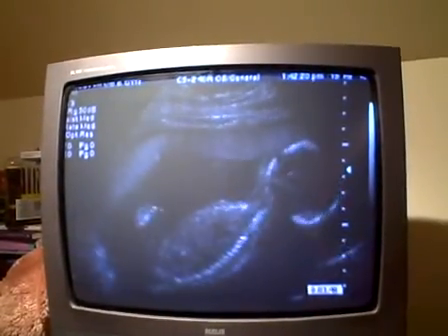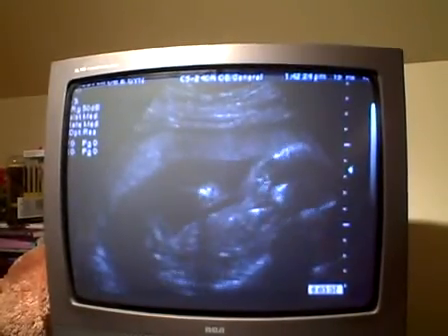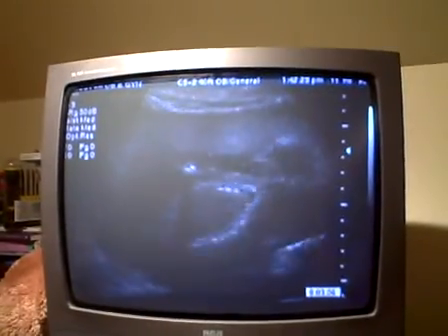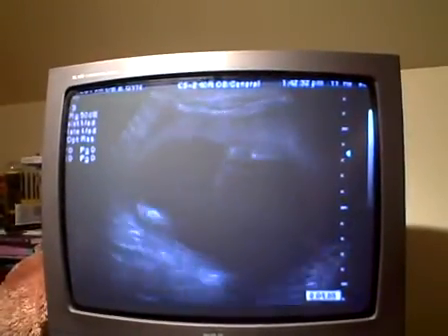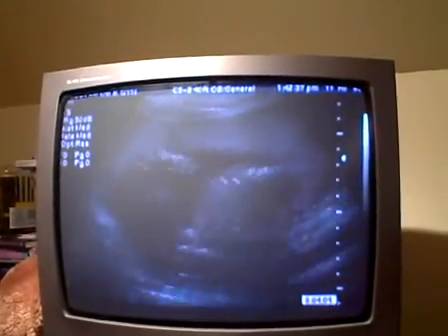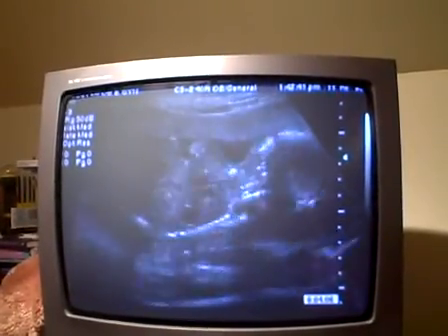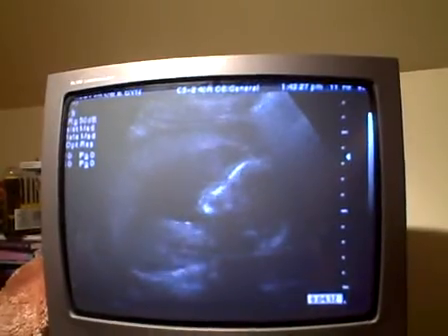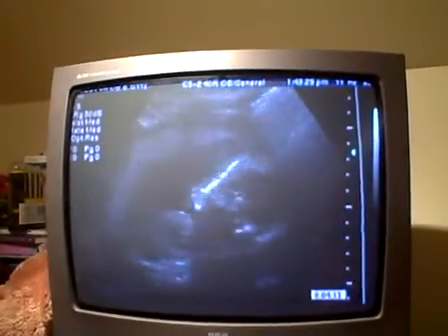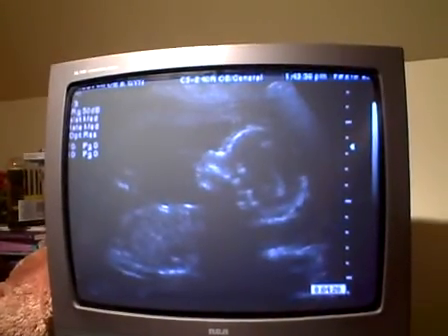Now we've got a profile. You can see the spine. You can see he's moving around — hands to his face. There's one hand. And look at the legs on the left, if you can see them — they're kicking. He's a total little froggy. And all the way up, kicking. There's a shot of his profile, and he's just moving around. There's the legs again, all the way up — kicking and stretching.